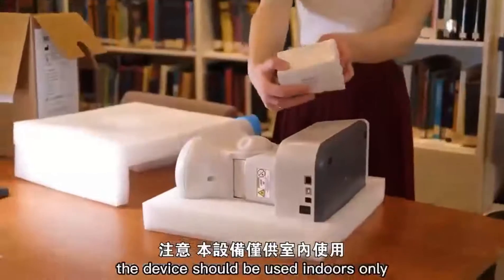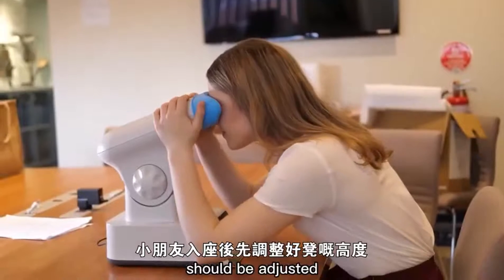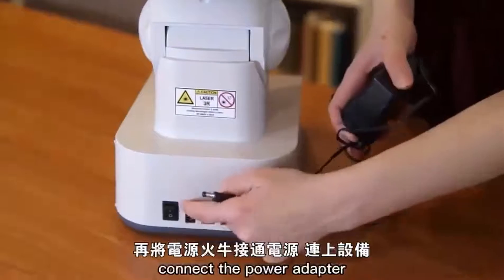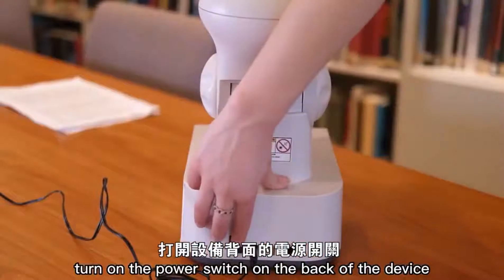The device should be used indoors only and is not to be removed when it is turned on. Your child should be seated and the height of the chair should be adjusted to ensure the device can be used comfortably. Connect the power adapter provided with the device to a power supply and turn on the power switch on the back of the device.